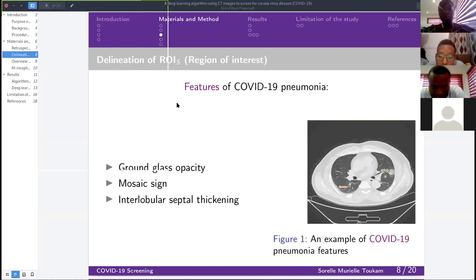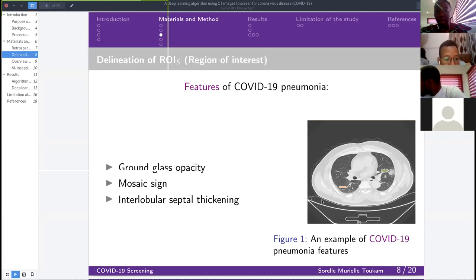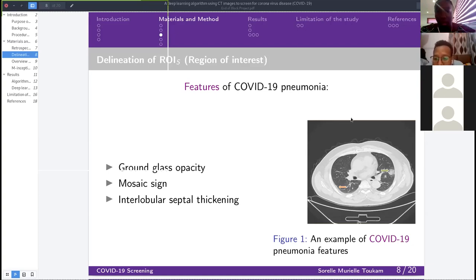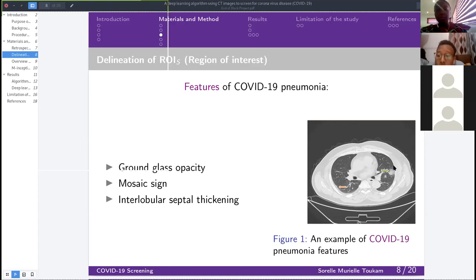Now let's talk about the features of COVID-19 pneumonia. Here I have an image of a chest CT scan — these are the lungs of someone who has COVID-19. We are interested in two main features: first, the gray circles on the lungs, which indicate infection. When infected, the lungs can fill with liquid, making it difficult to breathe — the grayer the lung, the more infected it is. Second, we look at the curvature of the lung.